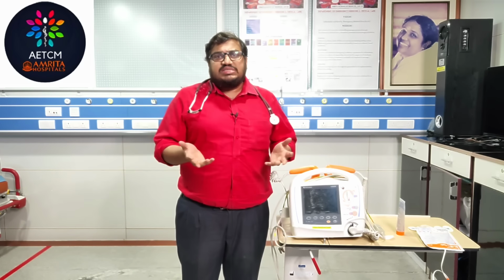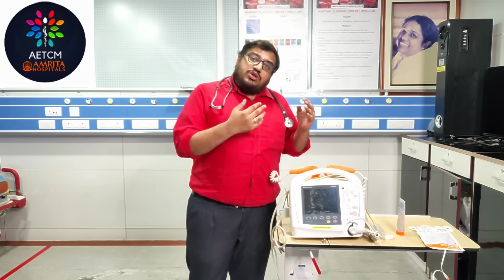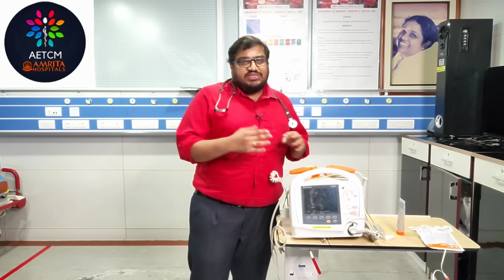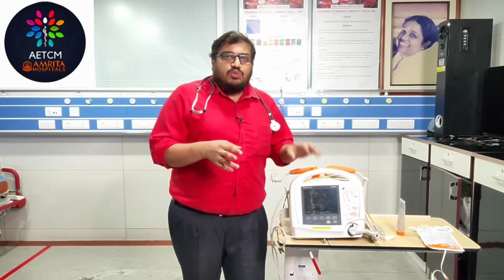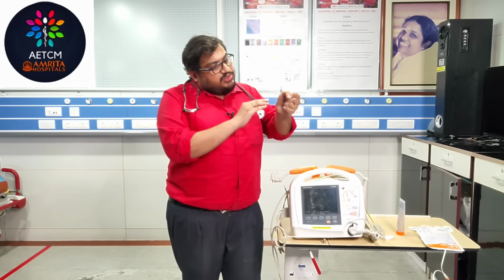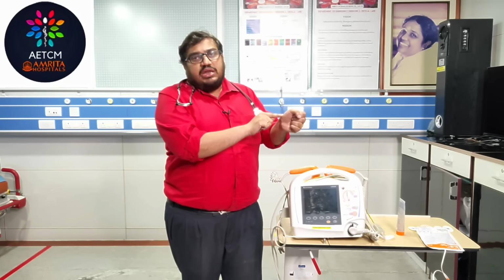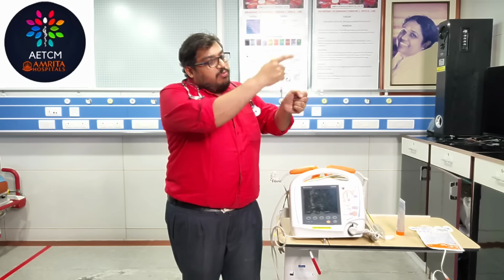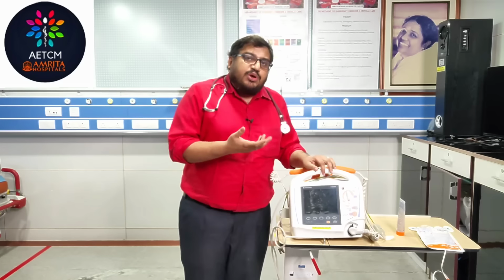What we commonly see now is a biphasic defibrillator, where both the paddles deliver the current. The basic difference is that in a monophasic defibrillator only one paddle delivers the energy, and in a biphasic defibrillator both the paddles deliver the energy. Suppose this is the heart: the energy comes through only one pathway in a monophasic. When it is a biphasic, from both sides both the paddles deliver the energy. So what is the advantage of that?